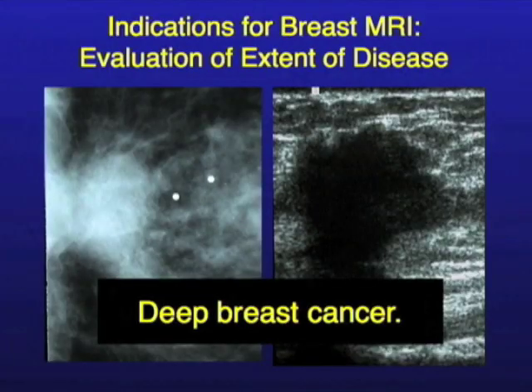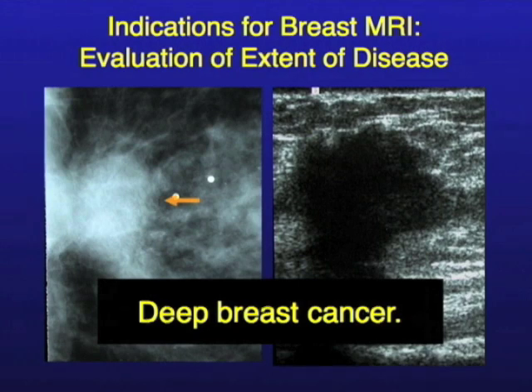This is a mammogram over here. This patient has a known cancer now that we've diagnosed, and this little BB means it's palpable — that means the patient felt it, so the tech puts that on there. Here is the cancer. This is the chest wall or part of the chest wall.